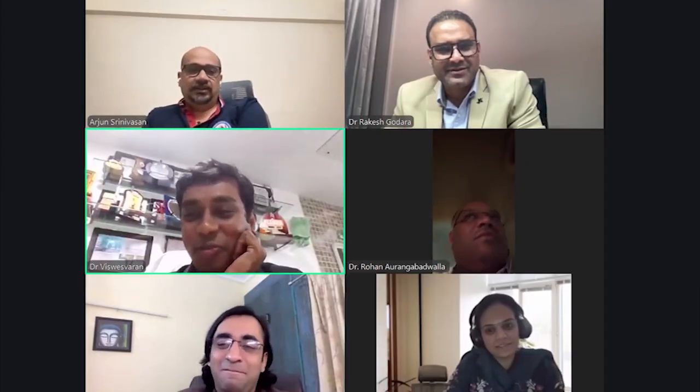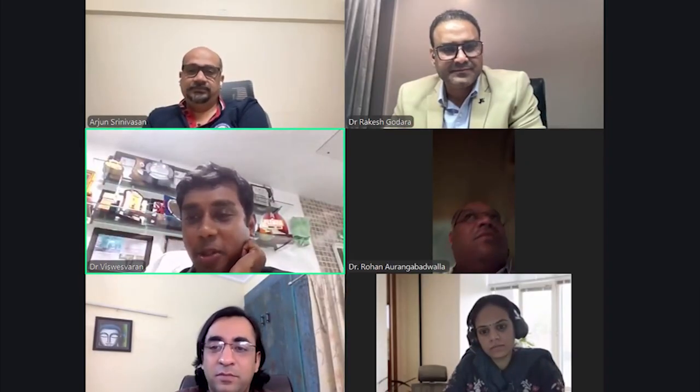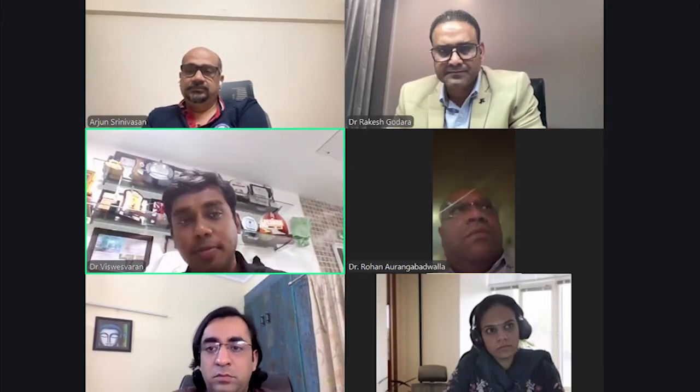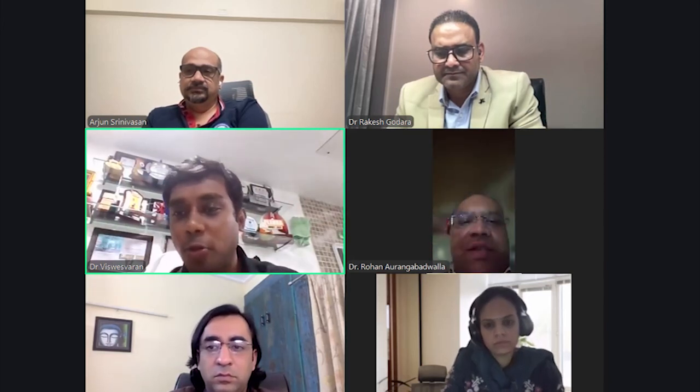And Dr. Ramesh from Delhi, this question is to Dr. Rohan. Why does cryotherapy usually not provide immediate airway opening, unlike laser or electrocautery? No, it does provide immediate airway opening. When you're doing cryo debulking, it does give you immediate clearance. It does actually. Yeah, true.